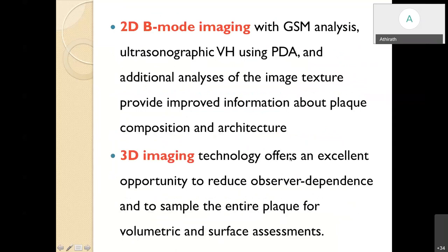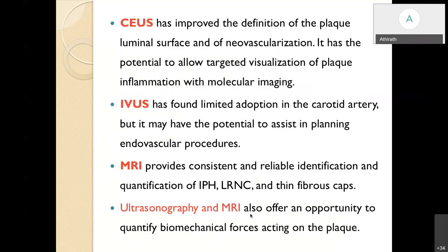To summarize all the non-invasive imaging techniques: 2D imaging techniques include grayscale median analysis and ultrasonographic virtual histology using pixel distribution analysis. They also give us analysis of the image texture. This gives information on plaque composition and architecture. 3D imaging gives us an opportunity to reduce observer dependence and to sample the entire plaque for volumetric and surface assessments. Contrast-enhanced ultrasonography will tell us about neovascularization within the plaque.